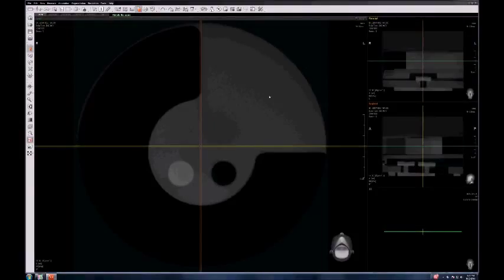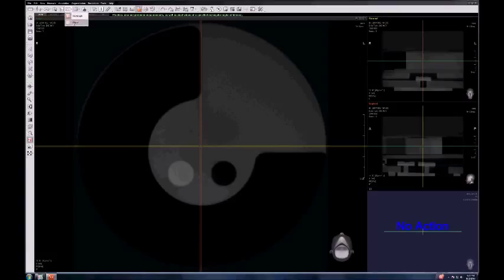We will need to read the CT number on these materials: water in here, Teflon in here, this one here we don't use, which is acrylic, and air on the opposite corner of the Teflon. Using the region of interest tool, create an area of about 20 millimeters square on each of those regions.